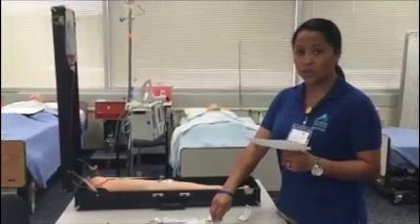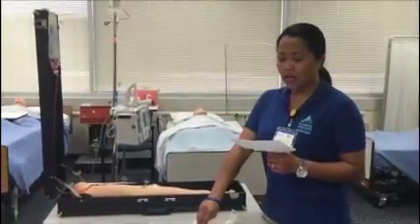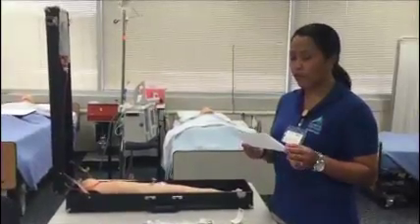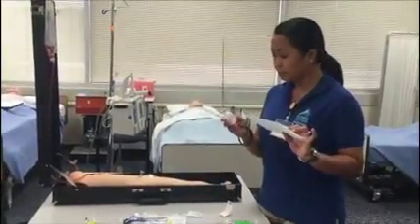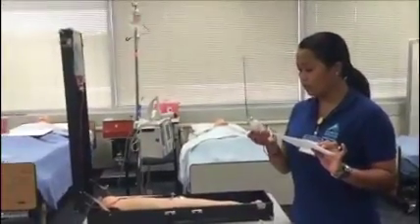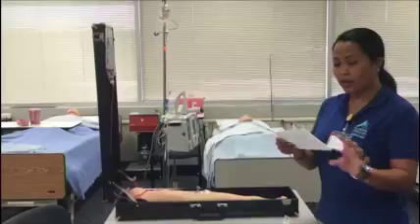The doctor's order is Zosyn, mixed with 300 milliliters of normal saline infusing for 4 hours, with 10 drops per milliliter. I'm checking my medicine, and its expiration date is June 1st, 2015, so this is still good. And this is my MAR, and I did my math.